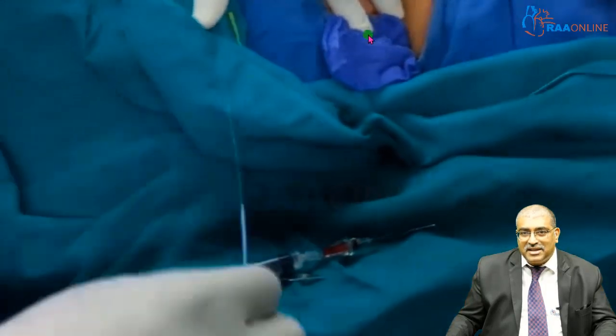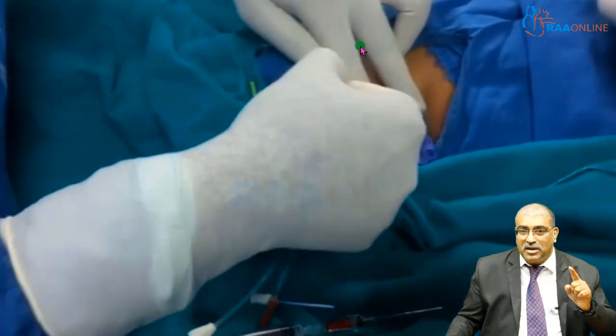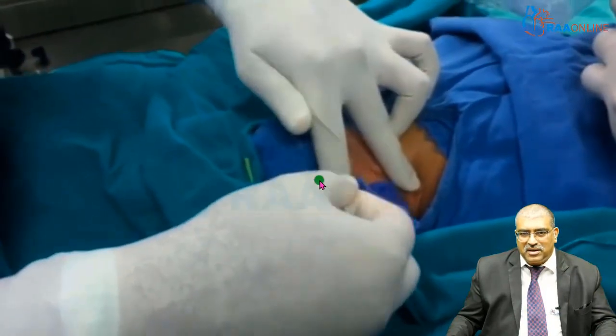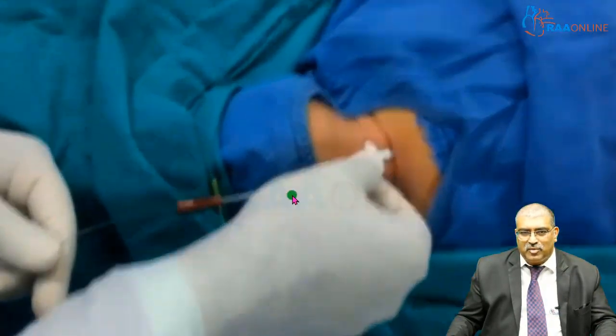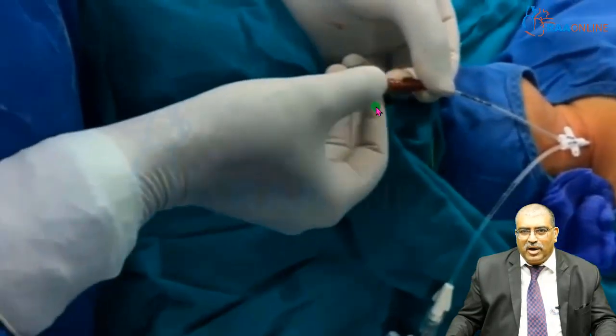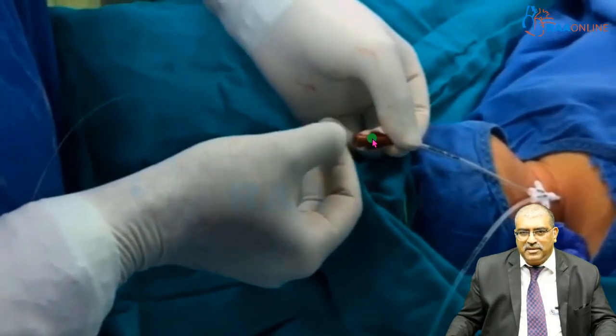The dilator is used for enlarging the skin and subcutaneous part. You should not enlarge the vein. Then the cannula is inserted over the guide wire, and the dilator is removed. Now the cannula is inserted and the guide wire is removed.